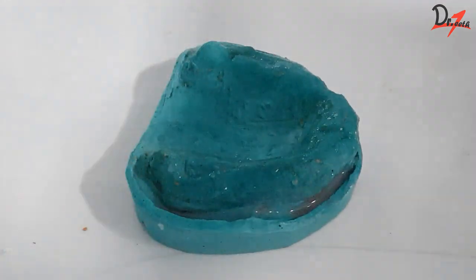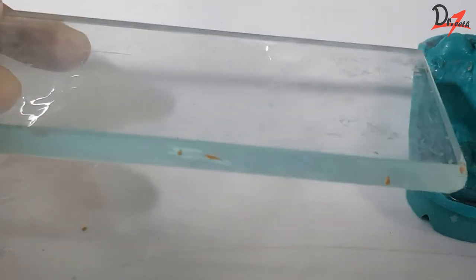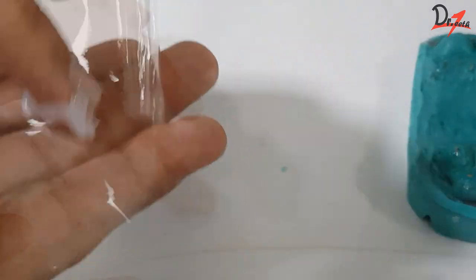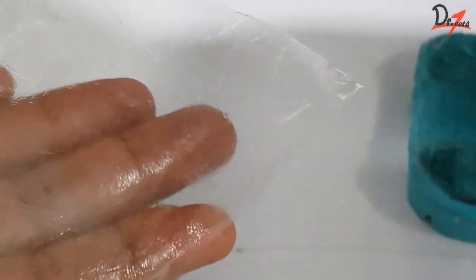I am going to take two separating sheets and a glass slab. Make sure that the glass slab is clean. We will apply petroleum jelly on these sheets so that we can easily separate them from each other when we make the dough. You can also wet these sheets and wipe off the excess water for the same effect.